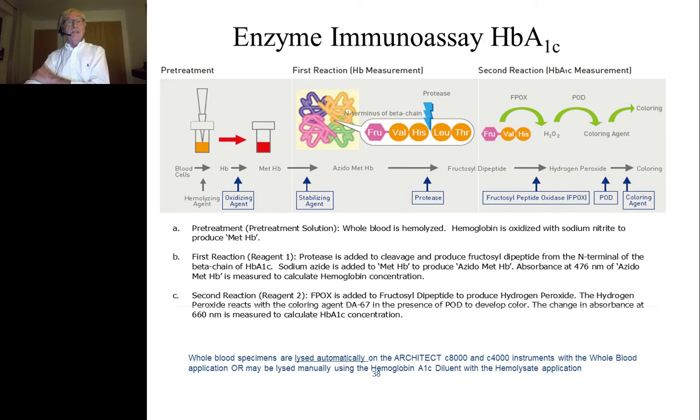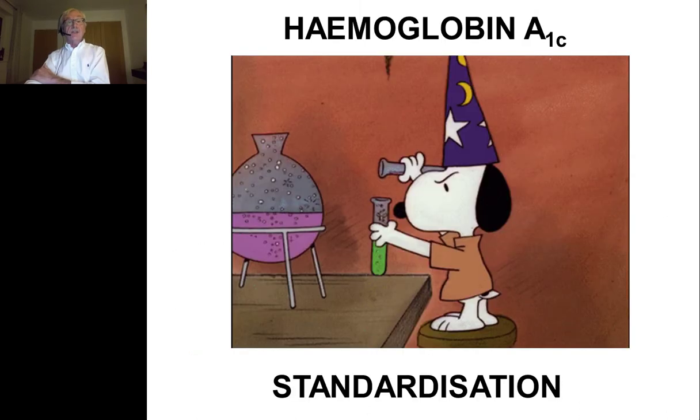All methods are actually extremely good and provide a good outcome, and it would be up to the laboratory which method they choose. But if you're going to choose a method, then the thing we need to consider is standardization.